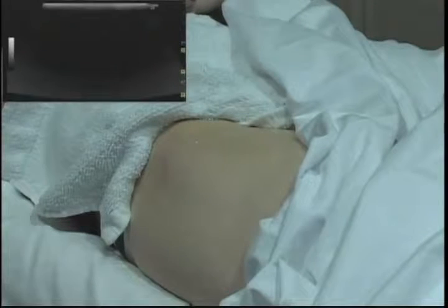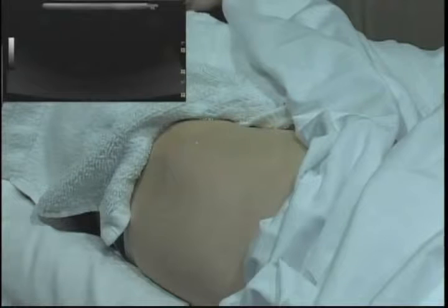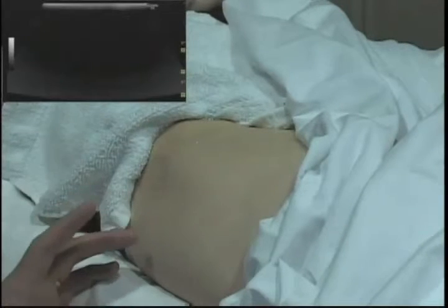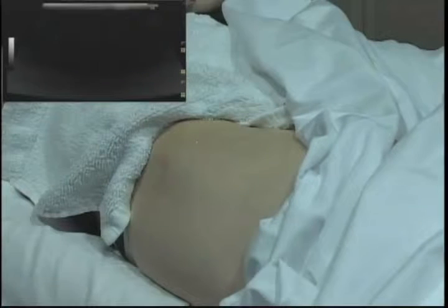The first one is looking at the hip joint itself, and then the next area I'm going to talk about for the anterior hip is how I evaluate a sports type injury, and the structures I look at anteriorly, including the common aponeurosis to the adductor tendons, and for iliopsoas snapping. And then we're going to look in the side of the hip at the greater trochanter. Then lastly, posteriorly looking at the hamstring.